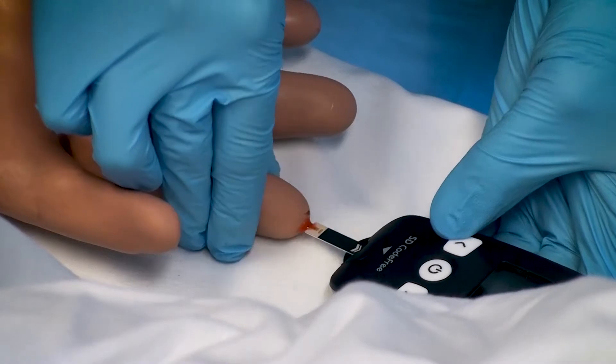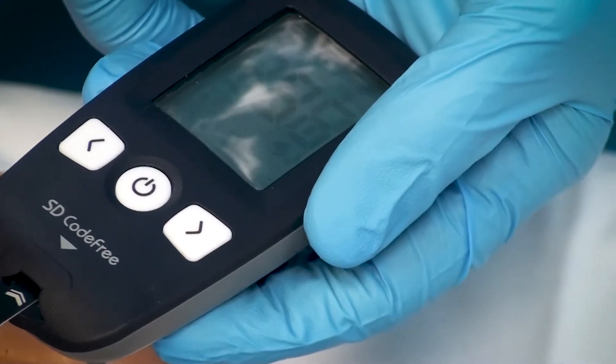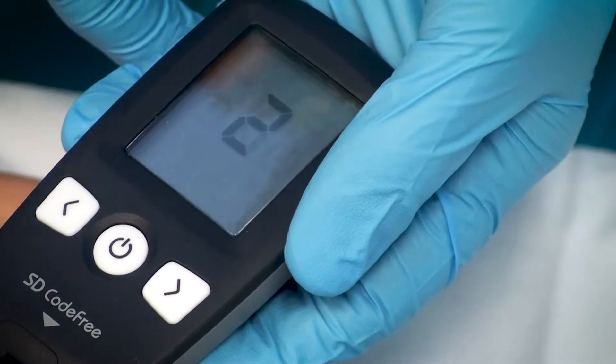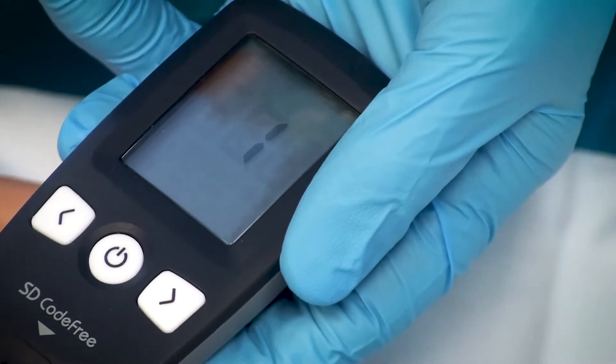Apply that drop of blood to the test strip in the meter and wait for the reading. The meter will count down and then display the patient's blood sugar.